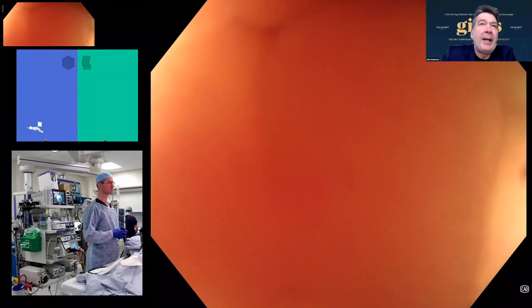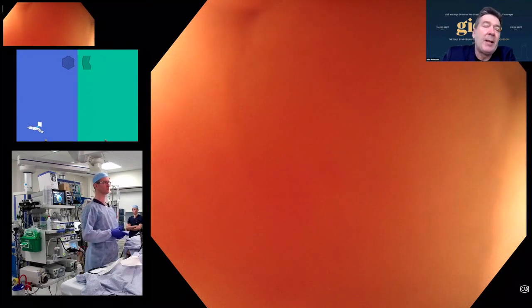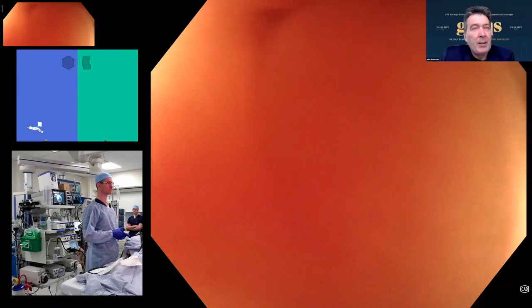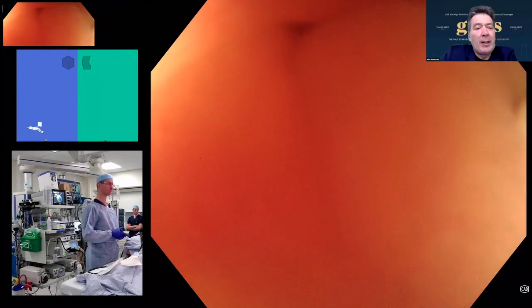The other thing that might help you if there are adhesions is definitely using an underwater technique. And the third element that might benefit you is having a distal attachment, and specifically a cap, because that will give you 2 or 3 millimeters away from the mucosa. And what that will allow you to do is have a better visual understanding of the direction that the lumen is going, if it is fixed or angulated, which might be challenging without the cap.